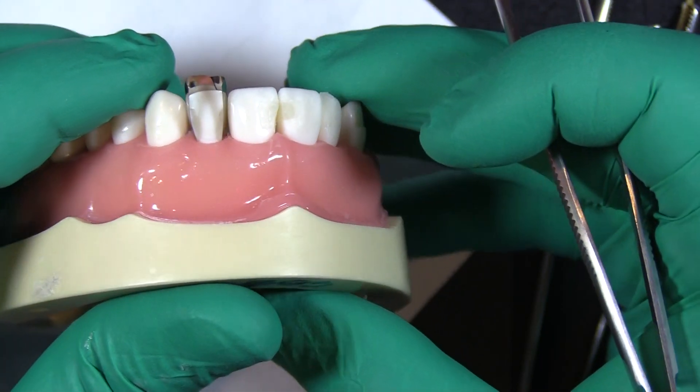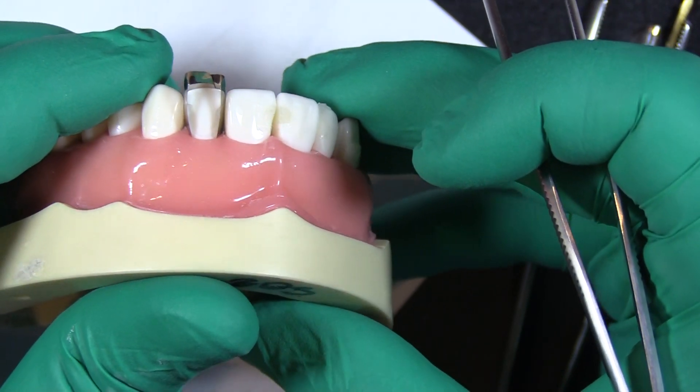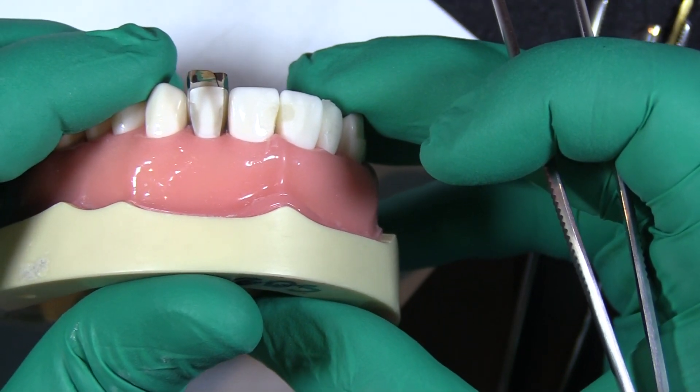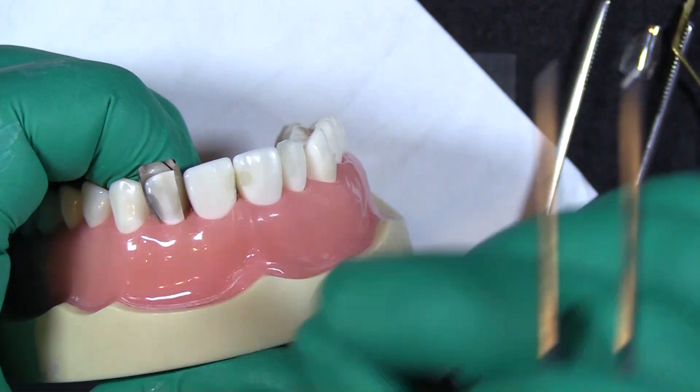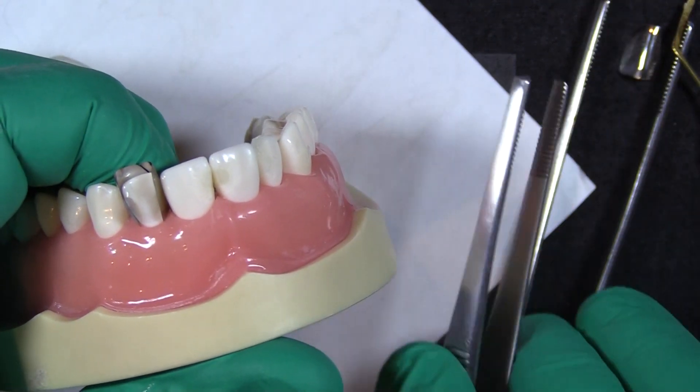These matrix bands just sit in a way that just allows me to be confident that I'm going to get at least very close to my end results without having to do a whole lot of fiddling with moving the thing or taking out the wedge, putting the wedge back in.